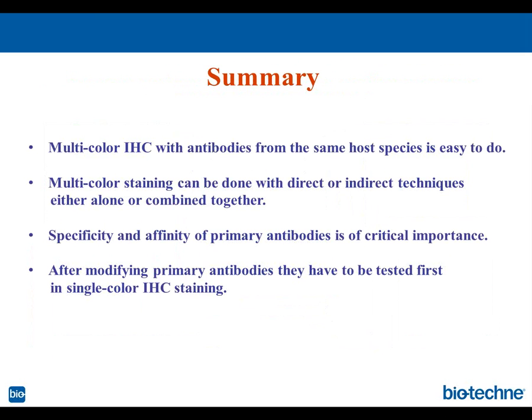Thank you. Does the conjugation to biotin or digoxigenin decrease the affinity of the primary antibody in a similar way to fluorescence conjugation? It's yes and no. To be precise in saying what's the extent of the inhibition of the affinity, we have to do a side-by-side comparison, conjugating primary antibody to the fluorescent dye and to digoxigenin, and we have never done these experiments.